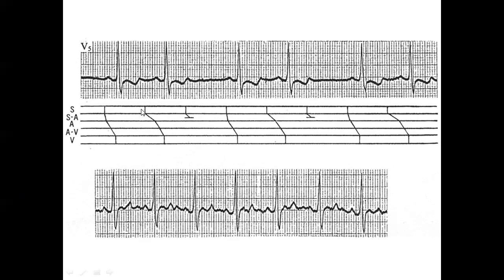So sinus node is firing regularly at that rate, which is what's happening here. Went to the atrium promptly, to the ventricle, went to the atrium okay, but with a delay, then eventually went to the ventricle. Sinus node fired somewhere here, but didn't get to the atrium, so no P. Promptly, delay, no P.